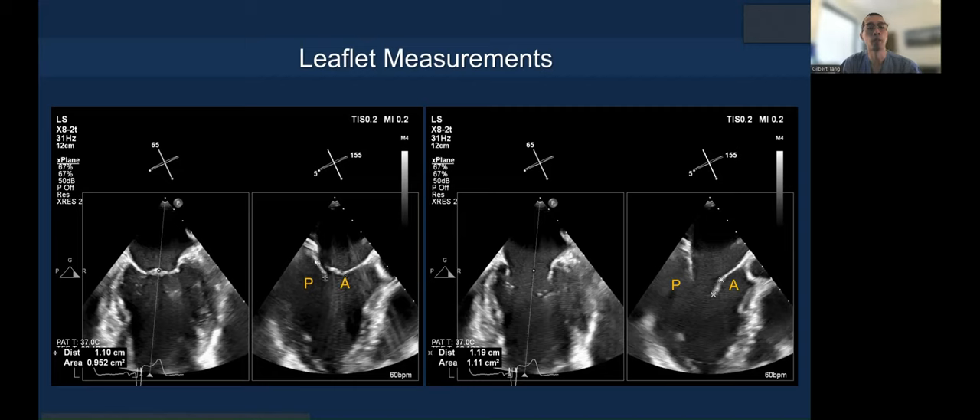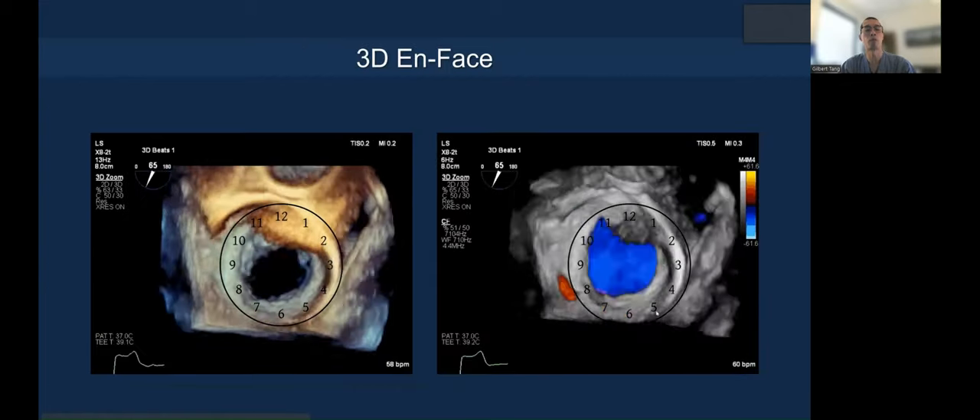The posterior leaflet measures around one centimeter, and the anterior leaflet up to the hinge point where the secondary cord is inserted is a little over one centimeter. You can see clearly that the XTW would be the preferred choice.